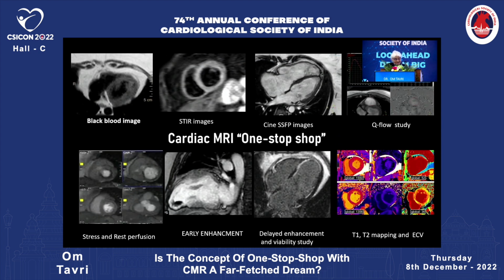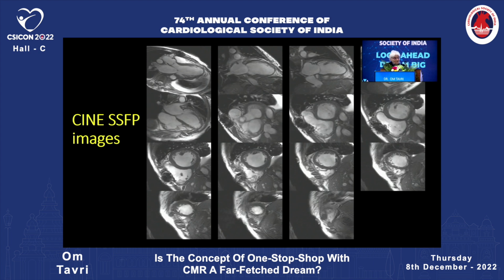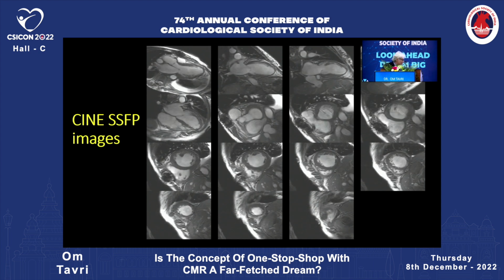Now, this is the study. Why cardiac MRI? You can see this study here very well, where all different types of images and different types of software can be carried out, studies can be carried out, and you can have a one-stop shop. This is what I want my cardiologists to see, images in one plane. You're not seeing one after another, after another. Please sit comfortably. You see from 3-chamber up to the short axis view, base to apex, everything is seen very clearly. You can see your hypokinesia, akinesia, dyskinesia, whatever, wall thickness measurement, everything. You sit, take your own time and see nicely. You'll be able to see it all in one shot here.